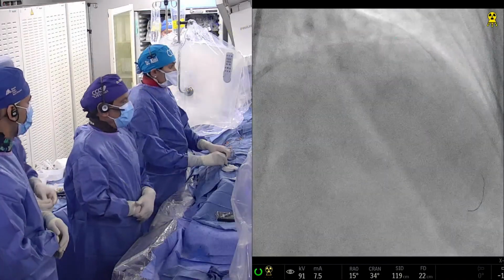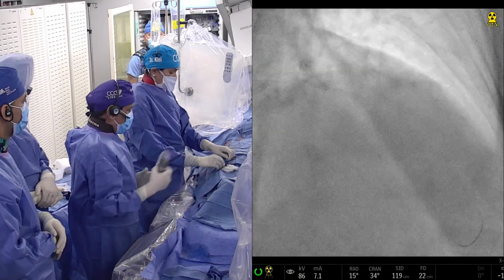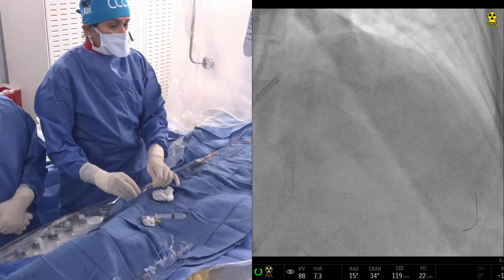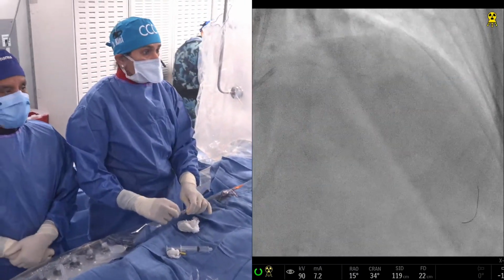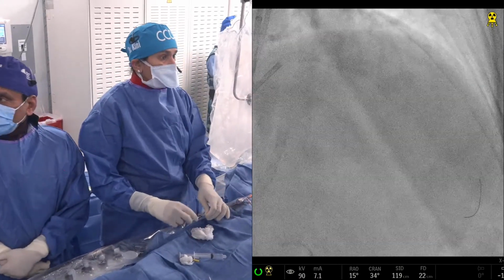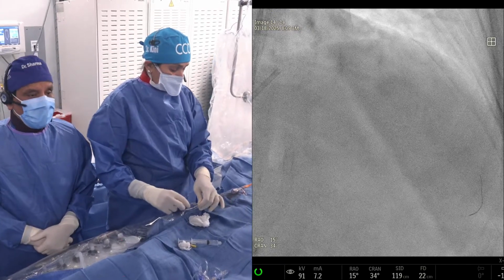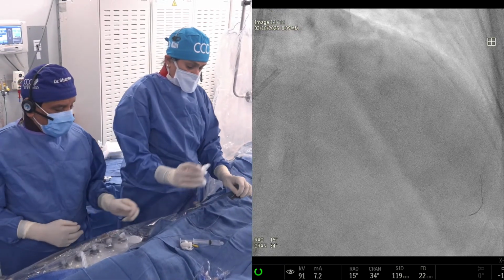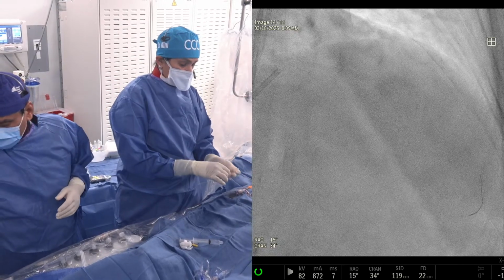As we always do, for the vessel which has been intervened before, we take a picture first, then go to the next. People ask why it is necessary. It's not uncommon, I would say 1 or 2% of the time, you start seeing clot or some plaque prolapse in your PCI vessel, not necessarily flow limiting, but once we know, we always try to take care of that part first. So this case went through the same process.